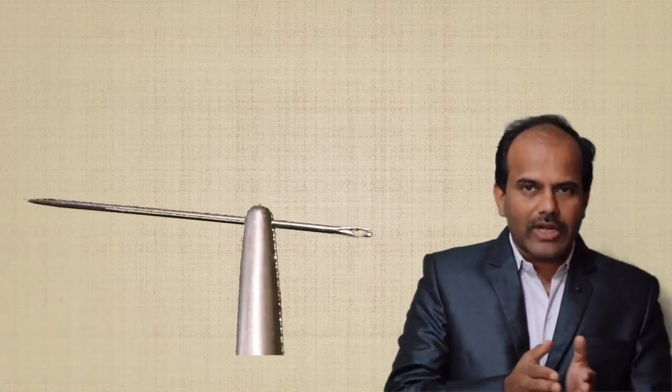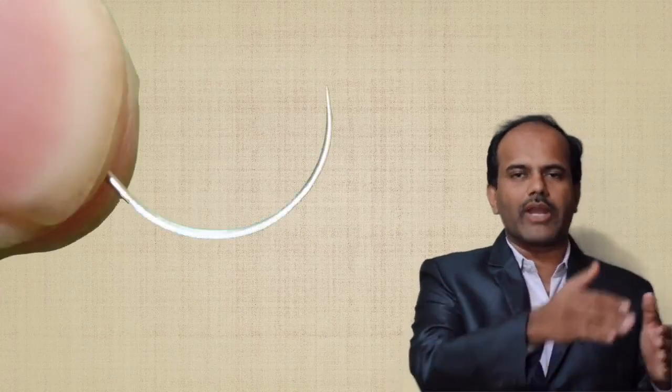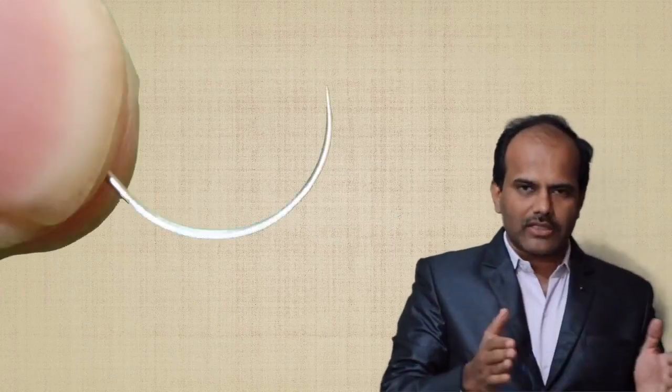With the round body needle, we need more driving force to enter the core, and I am just separating the tissue, as I separate the mob to reach the core. So the separation and damage will be less. When we expect less damage, in those conditions we can use the round body needle.